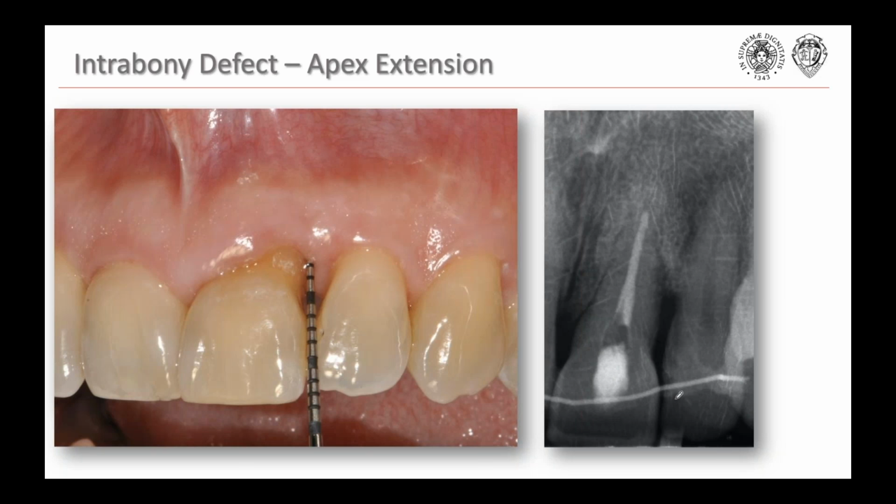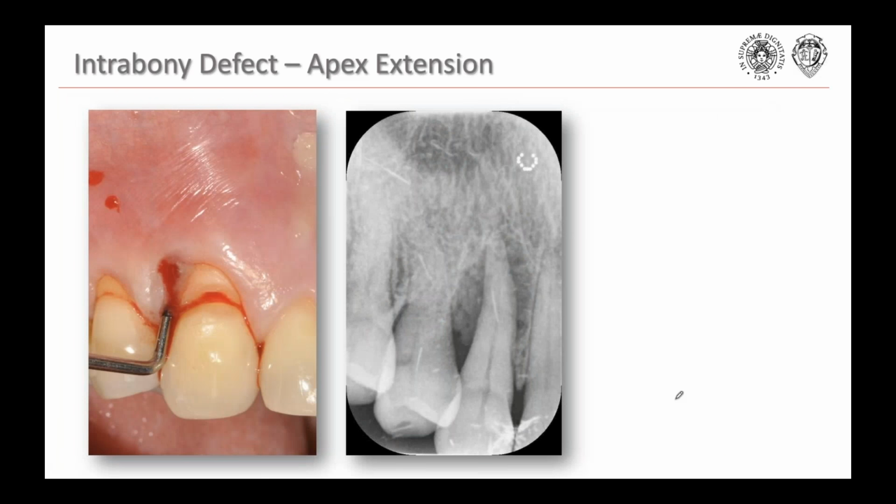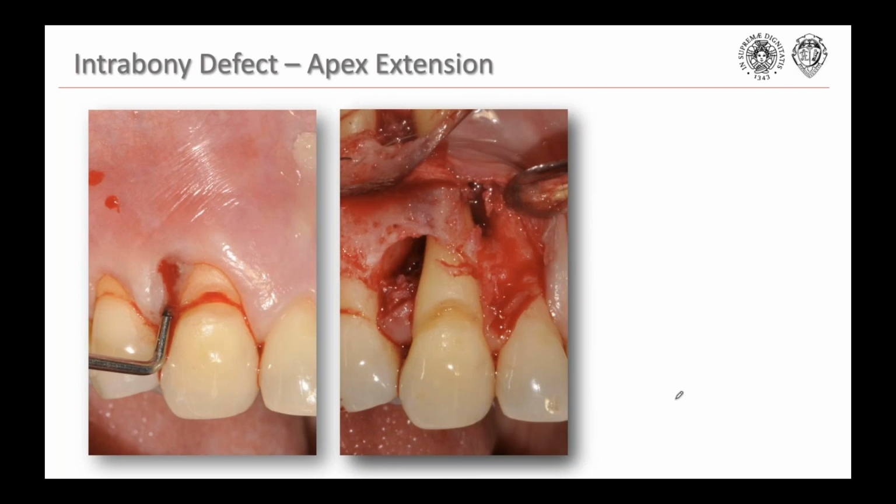The point of periodontology is to change the prognosis of teeth that are affected. But it's not about the material, it's really about the comprehension from a biological standpoint. Look at this case, we have 14 millimeters of attachment loss. We see the defect is moving circularly around the tooth.